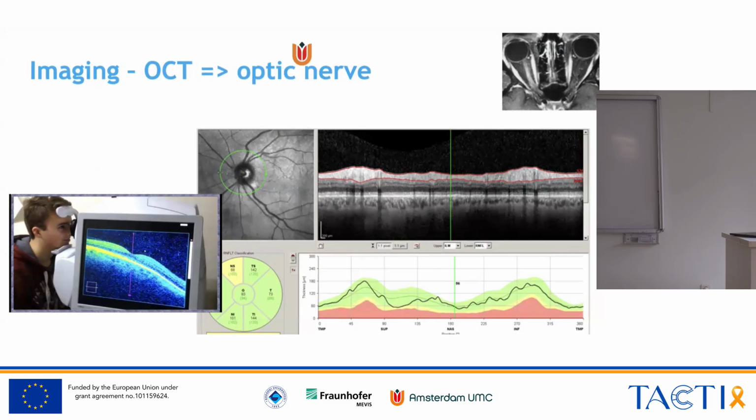This is an OCT. I think it's not yet available in your clinic. You were buying one or you have one? No, we have also. Okay, yeah. And do you also have access to OCT as the neurology department? Yeah, we have an OCT machine. Okay. In Istanbul University, not in the ADEM hospital, but if we need, we can access. You can access it, yeah, okay, yeah.